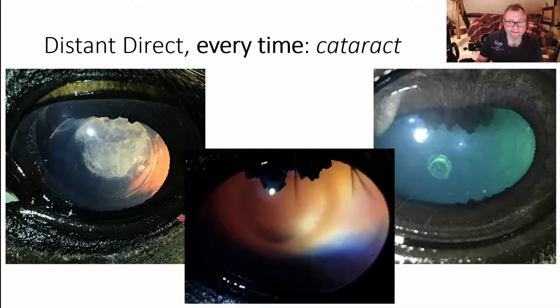For cataracts, distant direct is our key tool. And particularly if we start moving around, we can get ideas of anatomy. You can see this left image. We see the edge of the nucleus, and within the nucleus this opacity. This is a normal lens, but actually you can see that the central part of the lens looks different to the more equatorial parts of the lens, and that's a normal aging change, nucleus sclerosis, that happens in all patients.